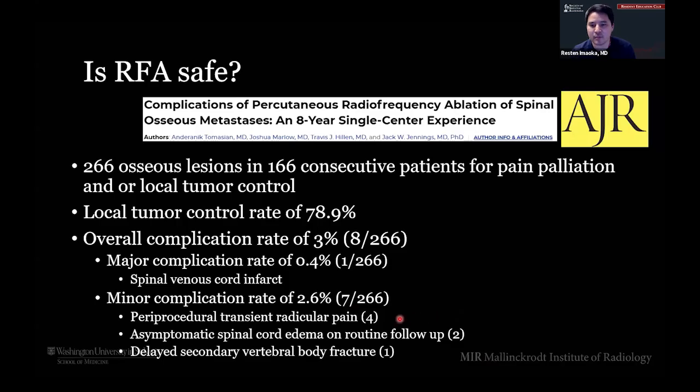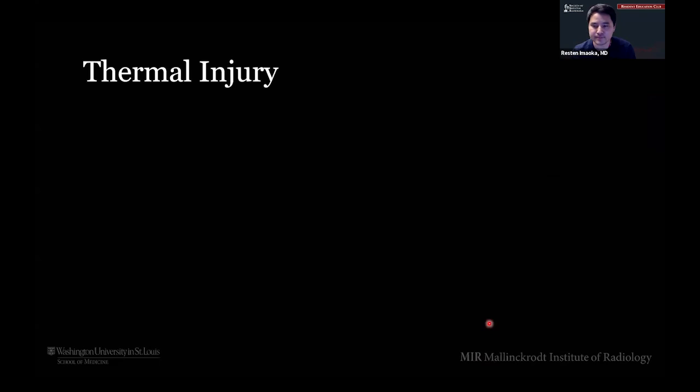Most commonly, it's going to be periprocedural transient radicular pain, or some asymptomatic spinal cord edema on routine follow-up, just no symptoms whatsoever. Or, back in the early days when we were doing RFA on the spine and we did not routinely cement it, you could see something like this where you get delayed fractures secondary to the osteonecrosis that you're inducing from the spine. So RFA is definitely safe in the right hands.